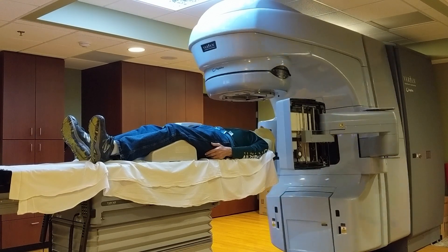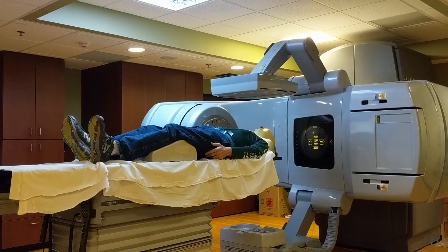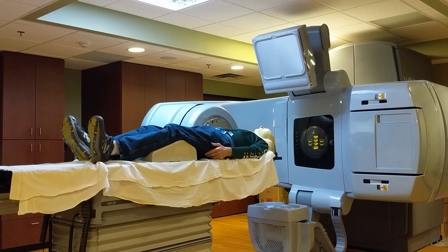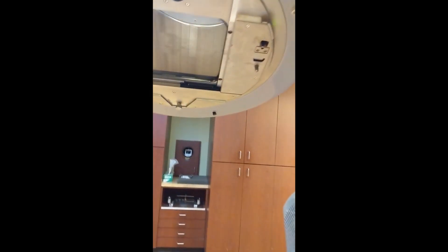A horizontal x-ray is taken, then a vertical x-ray is taken, and it uses that information to determine the exact location my body needs to be moved to to be exactly in the correct position. At this point, I'm feeling very minor movements of the table to get in position.